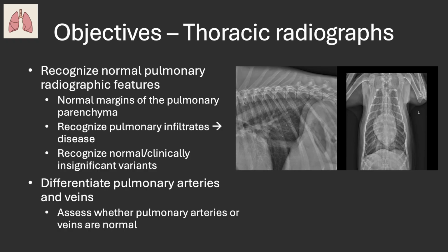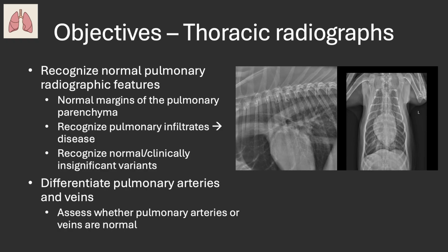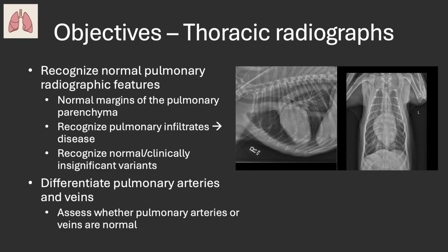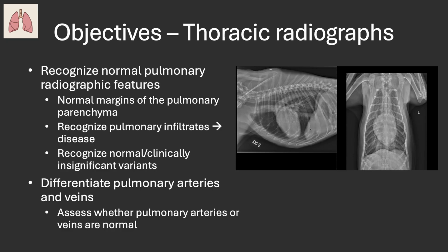These principles will form the basis of your evaluation of the pulmonary parenchyma on thoracic radiographs. By recognizing radiographic abnormalities and through an understanding of disease processes, you will grow in confidence when drawing logical radiographic conclusions for your clinical patients.